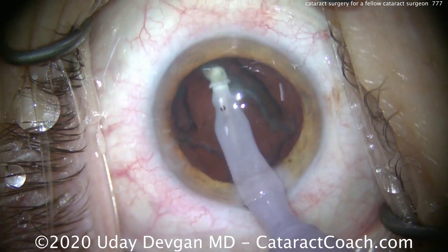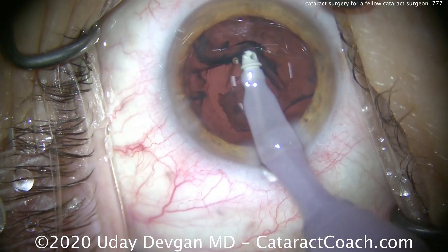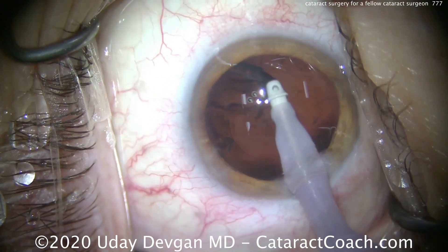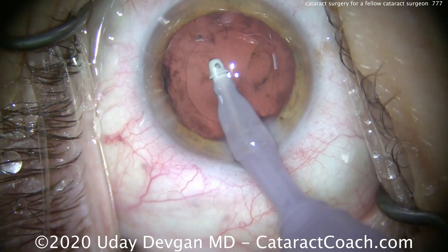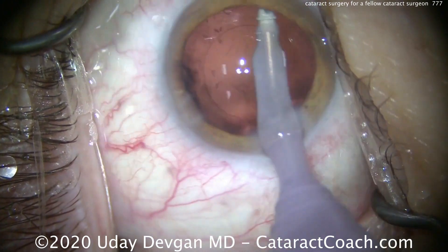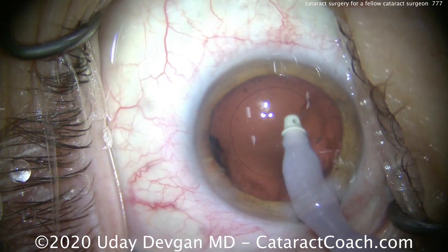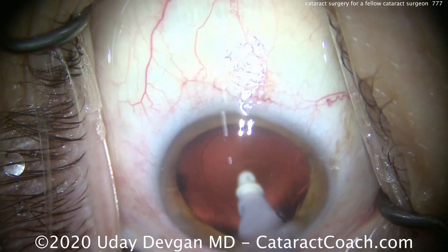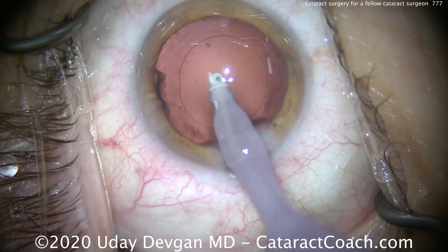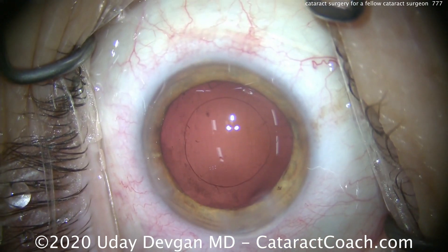A good question is how much capsule polishing do you do? We want the capsule very clean — I don't want fibrosis in the post-op period. But we also have to be very delicate; we don't want to damage the posterior capsule, especially since the patient is a cataract surgeon too. We've cleaned everything up, and now we'll polish up that anterior capsular rim and really clean up the capsular bag. Notice also the draping — all the eyelashes out of the way, the lid margin totally sequestered, to keep things very clean.